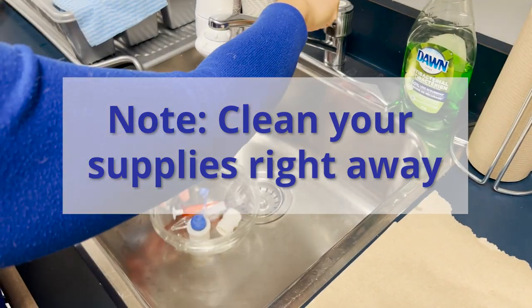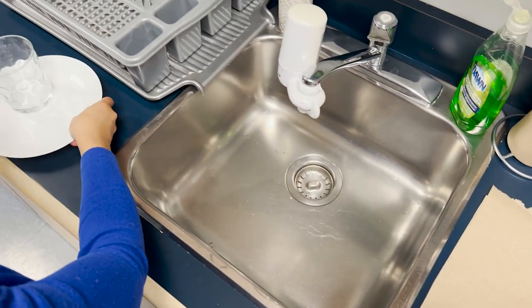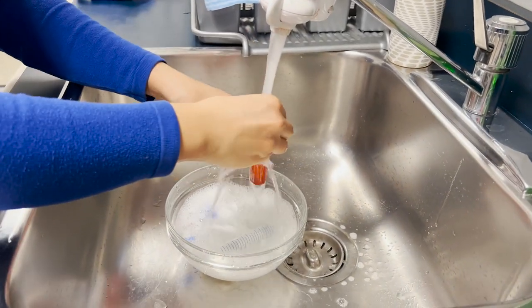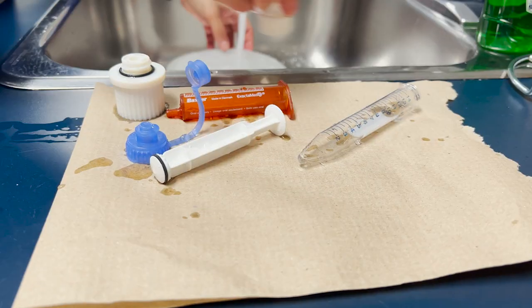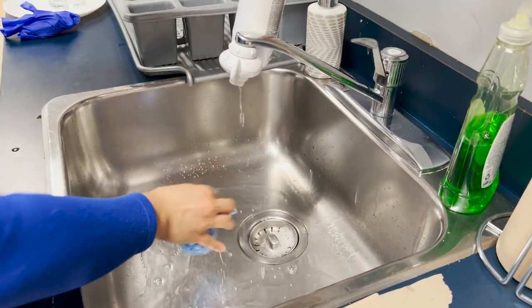You may wash and reuse some of your supplies, but take care not to rinse them in the kitchen sink over other dishes or utensils. Instead, you may choose to place the items in a bowl or cup rather than directly in the sink. If you are reusing an item, rinse it with warm soapy water and let it air dry. Clean the sink after washing your supplies.